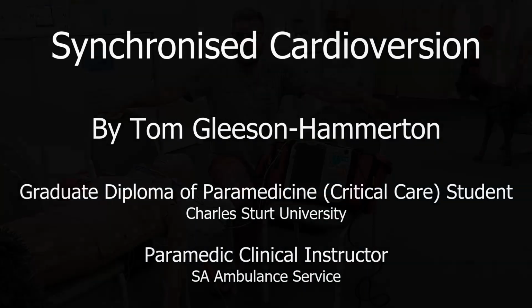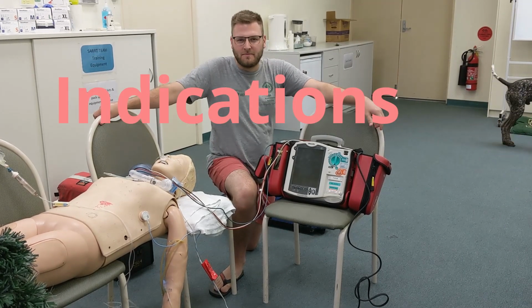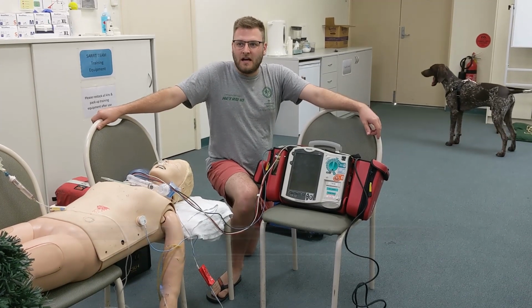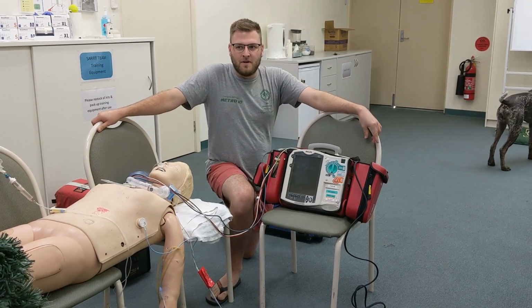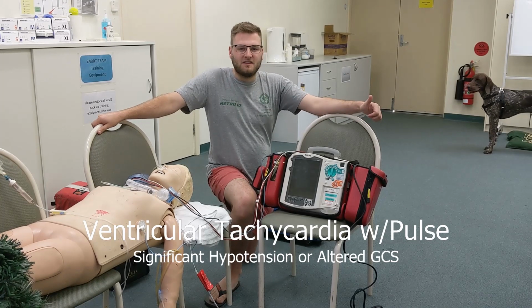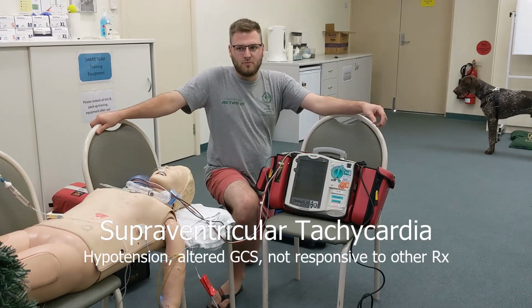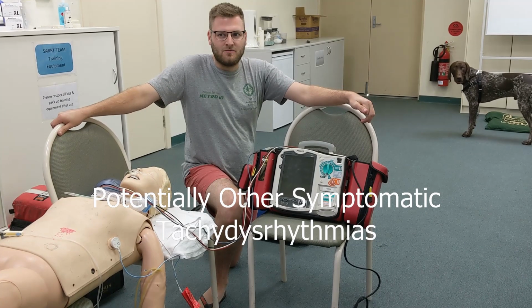Synchronized Cardioversion. Synchronized Cardioversion is used to restore a normal heart rhythm in a patient that is hemodynamically compromised due to a tachydysrhythmia. And it's usually severe hemodynamic compromise. Rhythms that we're going to see with this are pulsatile VT with significant hypotension, SVT with inadequate perfusion, and also probably other symptomatic conscious tachyarrhythmias.